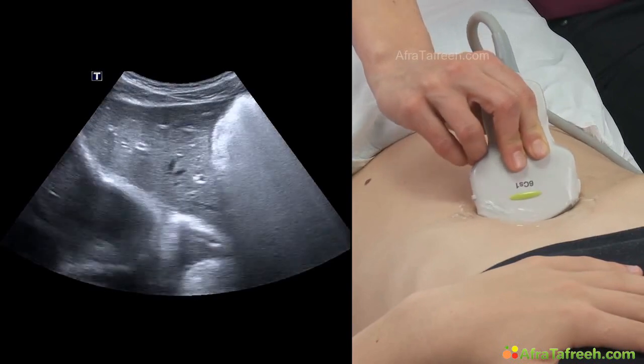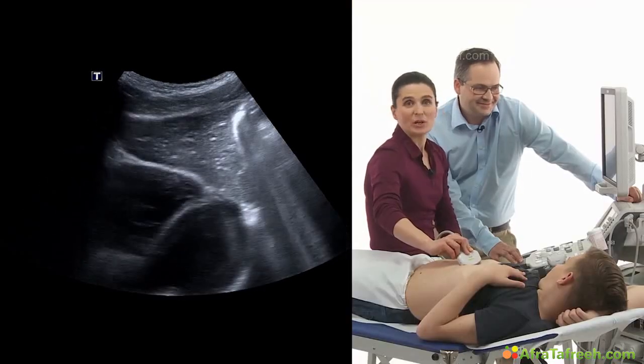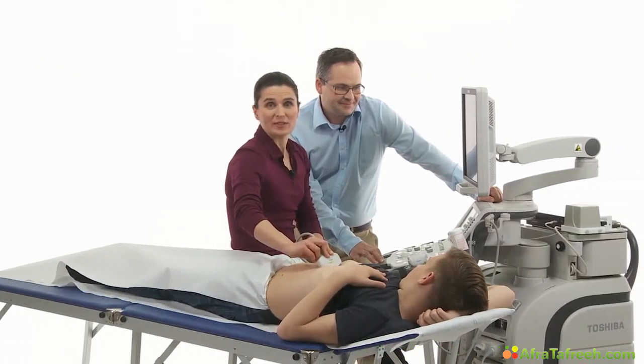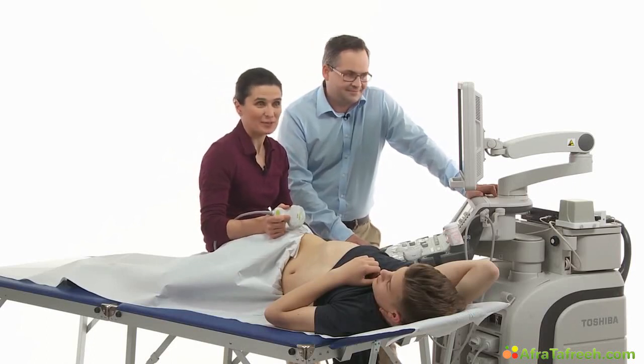You have already seen the heart. Do you want to perform an echo? Nearly, yes, but actually we're really very close to the heart with these liver segments over here. In the next scan, in the cross scan, we will see some interesting landmarks. Can you show us? I'd love to. Actually, this is my favorite part of the liver scan.